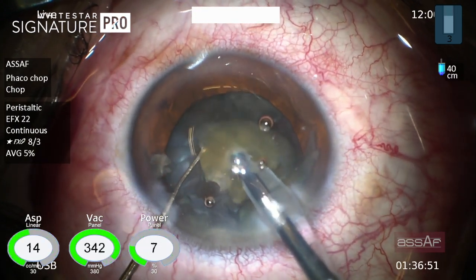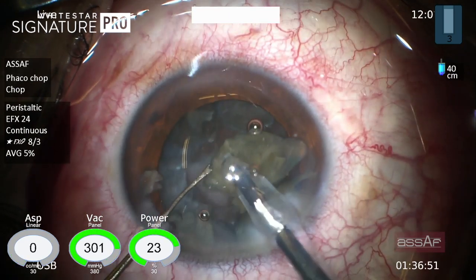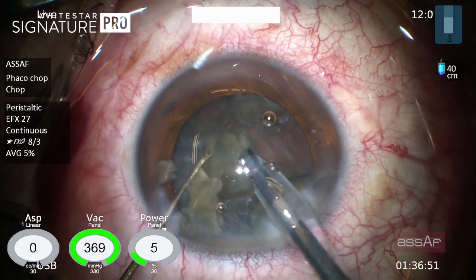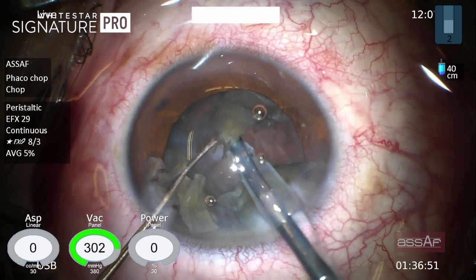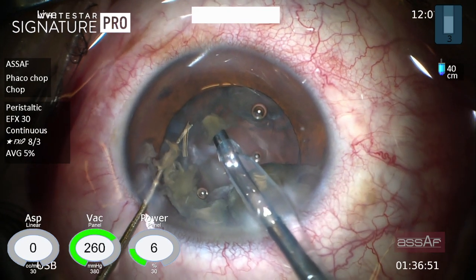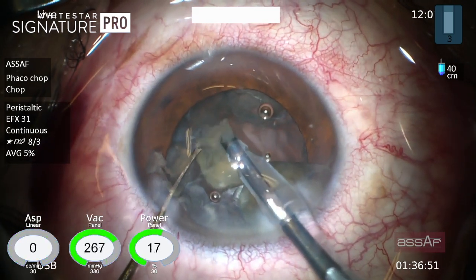In this case I set the vacuum initially to 380 mmHg, and after one second this vacuum is instantaneously reduced to 267 mmHg anticipating occlusion break. This enormously improves the stability of the anterior chamber in the setting of weak zonules and low infusion pressure.